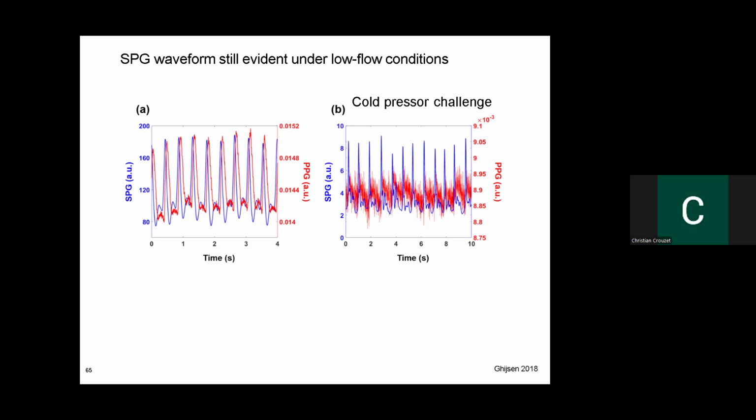We have not put two devices separated apart to estimate blood pressure. There is work being done by us and others to use the SPG signal basically to look at blood pressure. We haven't done it to look at pulse transit time, for example, which may give additional information, but I think that's something that can definitely be done.